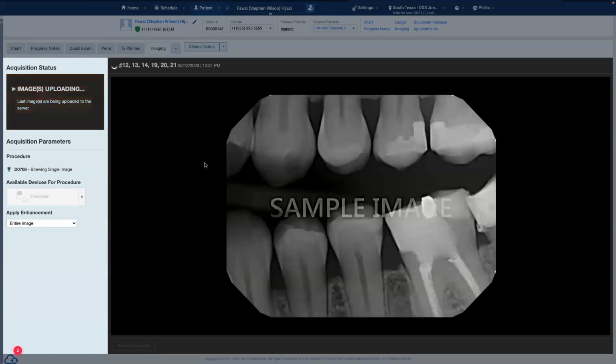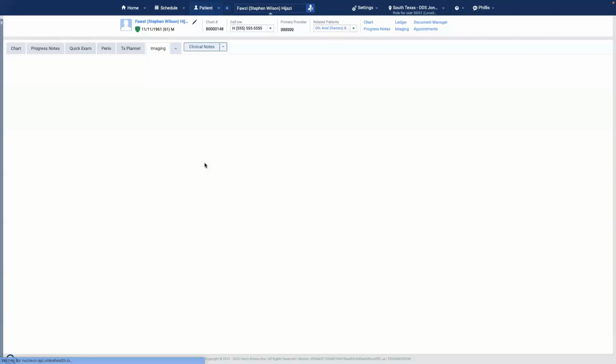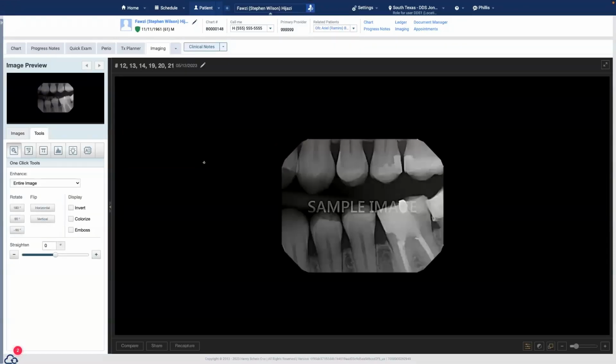Adam, I'm going to interject again here, because that's one of the most important things about Dentrix imaging, and that's directly posting to the ledger. You don't know how many times us as dentists realize, oh my God, they took an X-ray, but it never got billed to the insurance company. Once you take the image, it automatically charges to the ledger and into the insurance company. Yep, that's exactly right. I don't think anybody else has that.